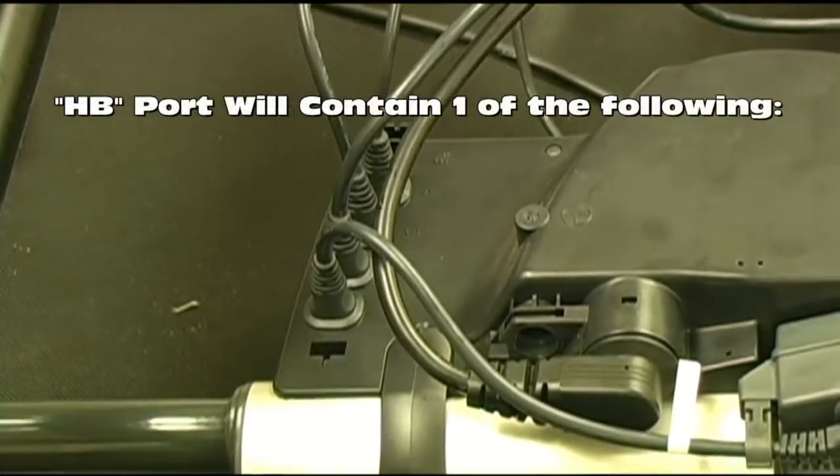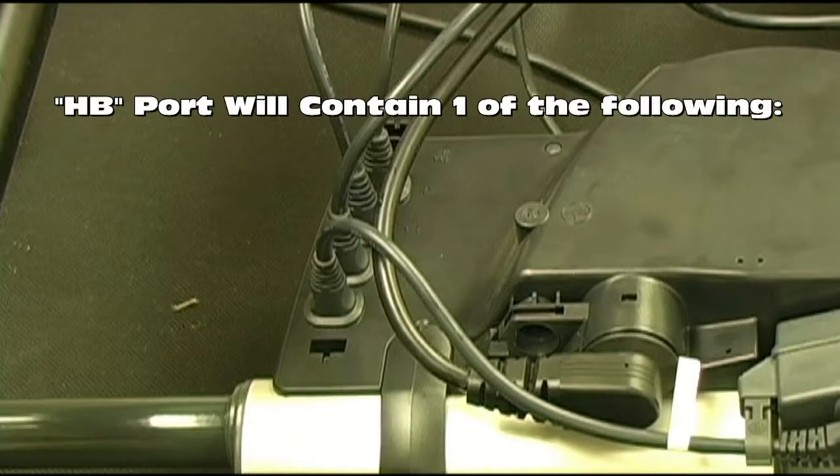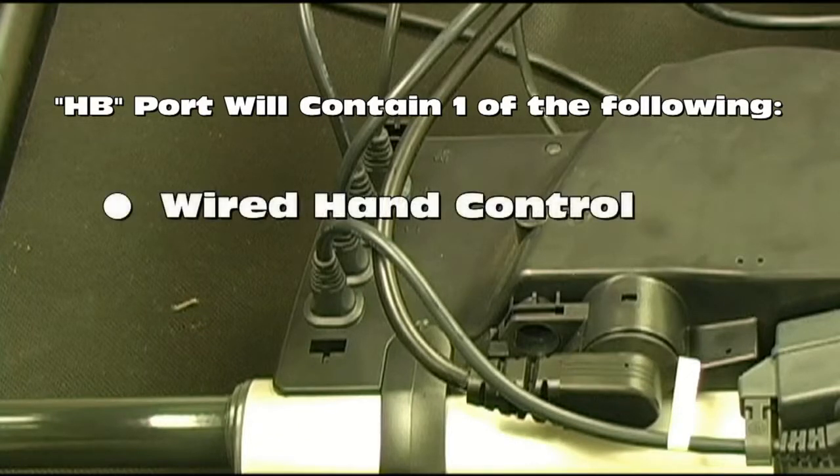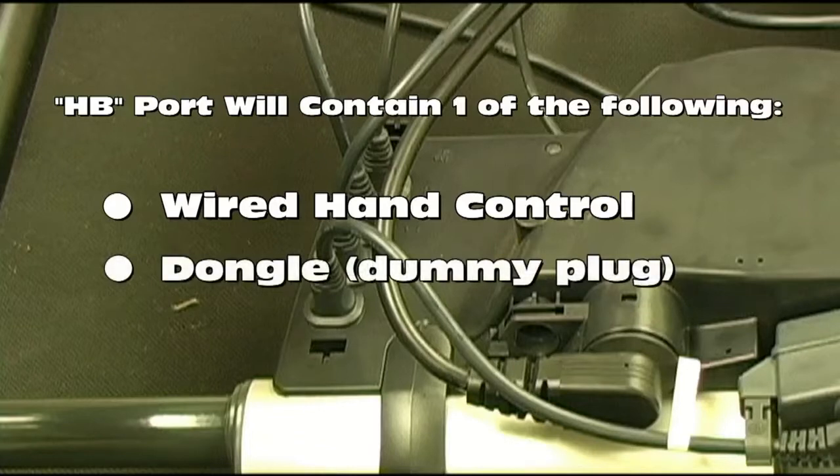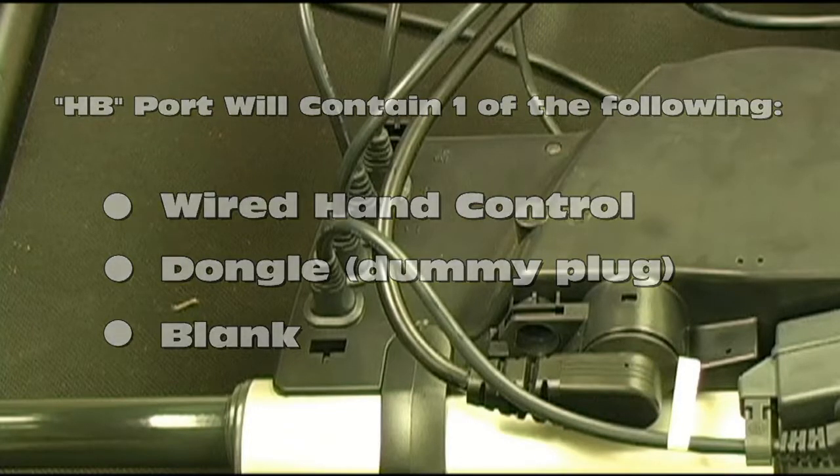The final port on the control box, port HB, will contain one of the following items. If you have a wired hand control, the white plug at the end of the cord should be plugged into port HB. If you have a wireless hand control and there is a second FlexiBed in your home, you will need to have a dongle, also called a dummy plug, plugged into port HB. If you have a wireless hand control and there is only one FlexiBed in your home, then nothing should be plugged into port HB.